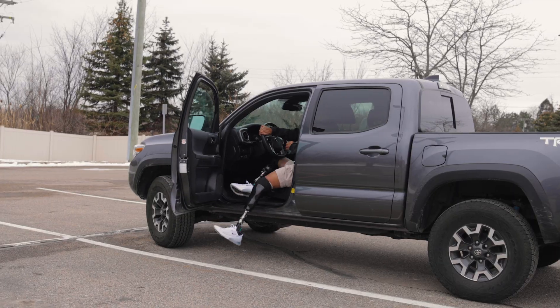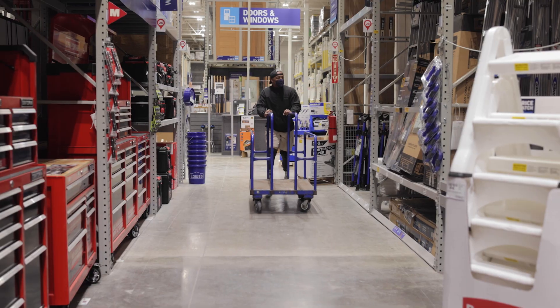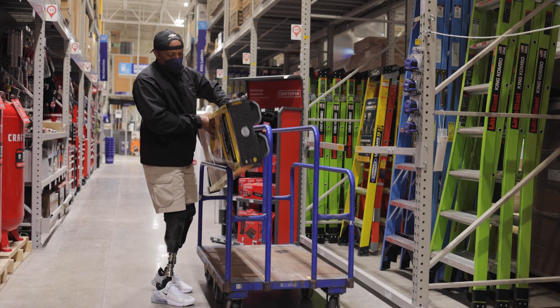The sleek new Voyager foot was designed to achieve ultimate comfort and rotation for your next adventure. You deserve to walk, jump, and move with ease.